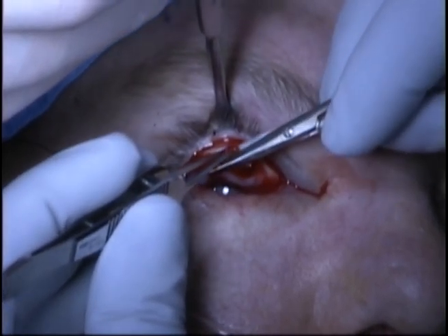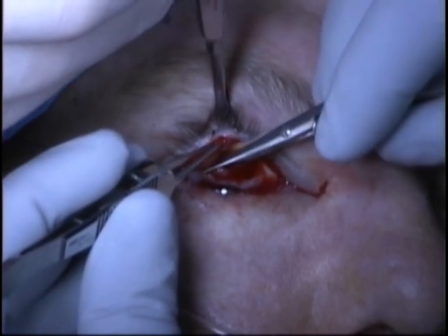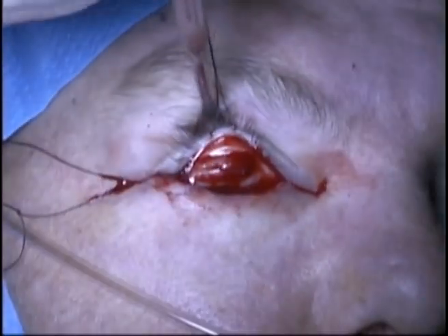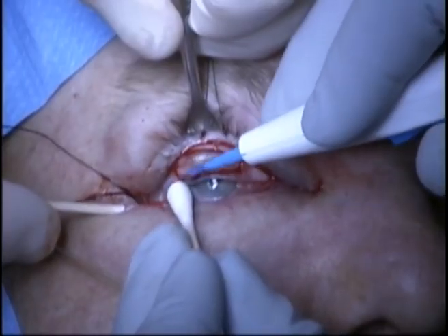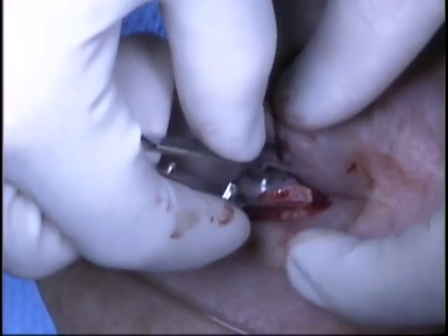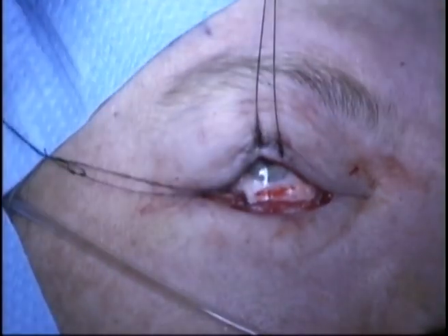The pre-tarsal orbicularis muscle is dissected from the anterior surface of the tarsus. The donor site does not need to be repaired. Hemostasis is assured with the cautery. The tarsal graft is then placed into the lower lid defect.